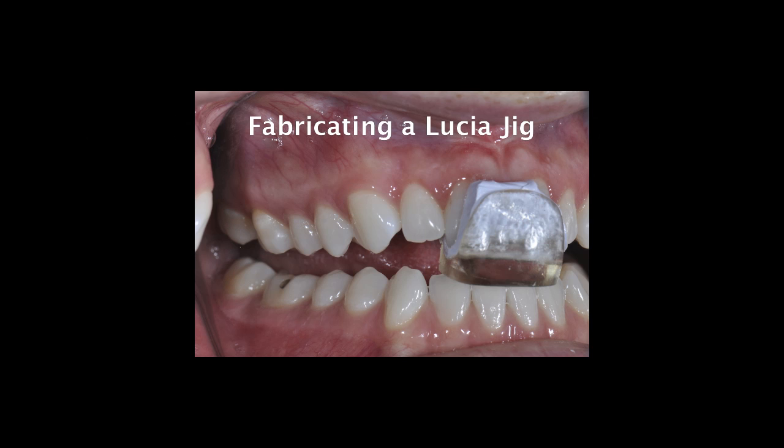In this video I'll demonstrate fabricating a Lucia jig. They go by many names like anterior deprogrammers and anterior bite steps. A Lucia jig is designed to give the patient a platform on which to occlude with their anterior incisor teeth, separating all of the back teeth and hence relaxing their elevator and positional muscles.